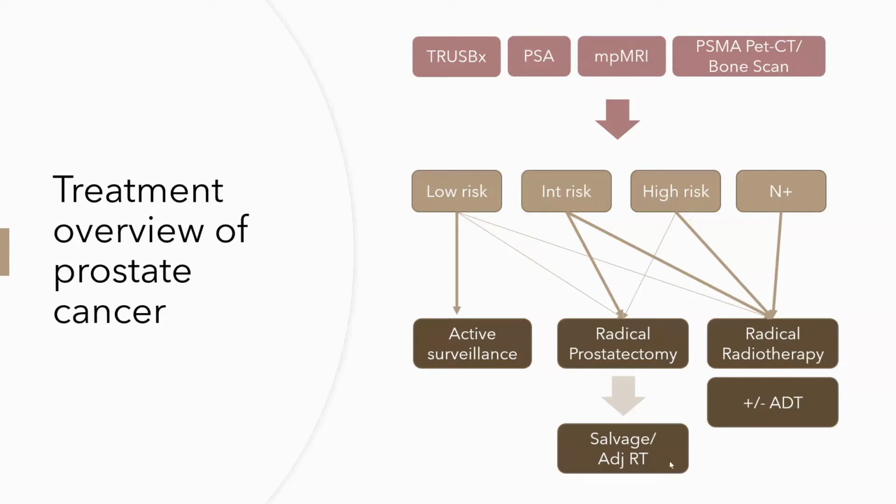So it is very important, as Dr. Gunaseelan mentioned, that prostate cancer is an increasing, chronic health problem. Therefore, it is very important for us to understand radiotherapy for prostate cancer very well. We are not going to discuss treatment, evidence and rationale, etc. in detail today because there's not enough time. So let us go into how to delineate targets for prostate cancer.